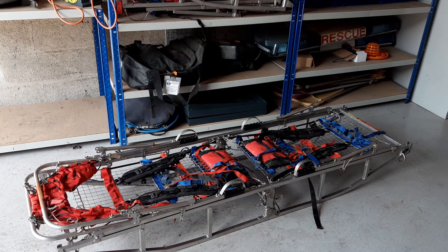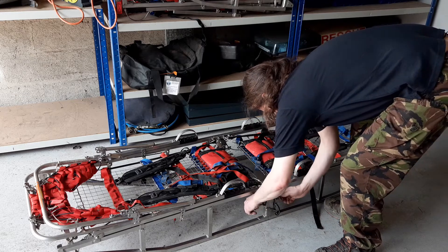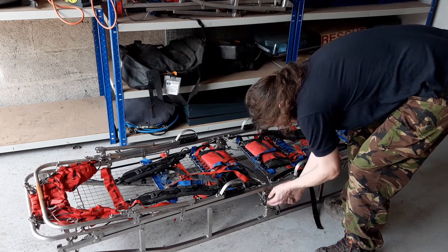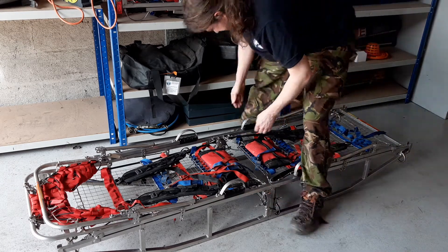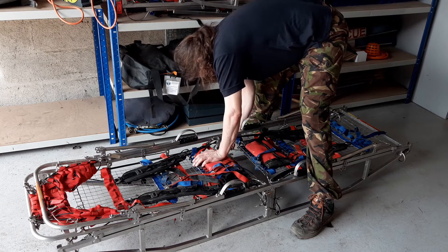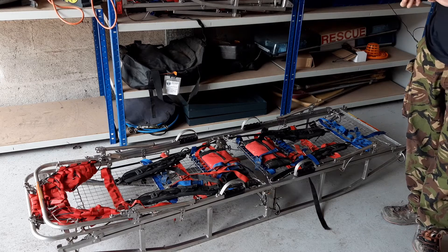There we go. Now as you normally would, go through and tighten everything up - make sure all the pins are in place. It is possible, you just need to be a bit more careful.